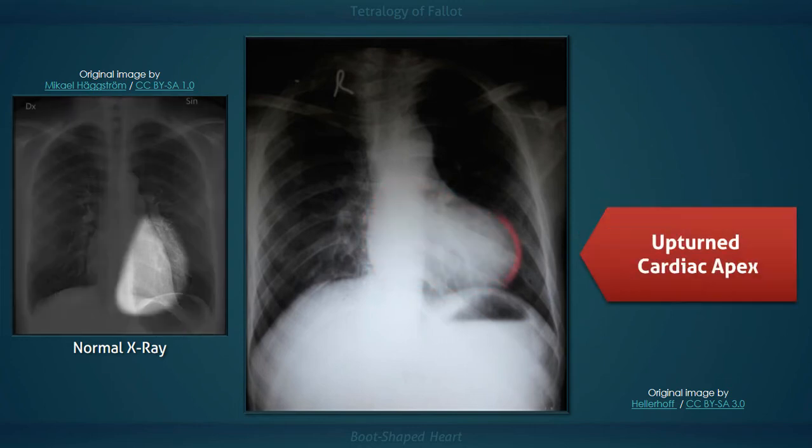This combination of defects results in an elevated right ventricular systolic pressure with ensuing right ventricular hypertrophy, which is a third defect in the classic tetralogy. In this radiograph, right ventricular hypertrophy has resulted in an upturned cardiac apex that is positioned abnormally high above the diaphragm.